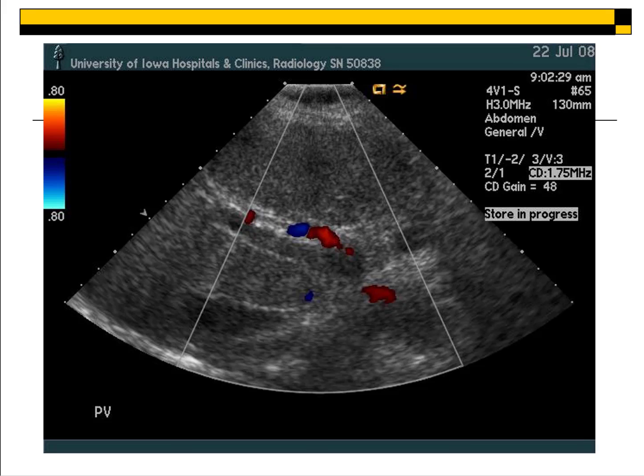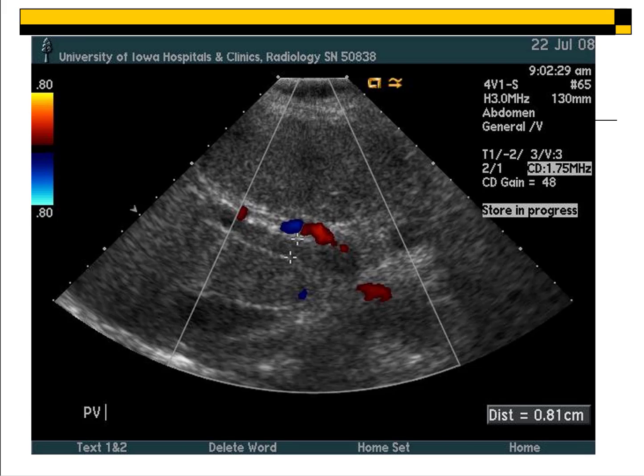So you can kind of see here, portal vein, we're not really getting any flow in there. And we're just demonstrating that at the main portal vein, we're not getting any flow. Did a measurement here. I know on this final report coming up it says possible cavernous transformation visualized. I don't really necessarily agree with that. We have a somewhat limited image here for my example.